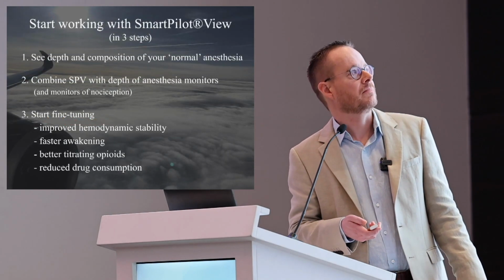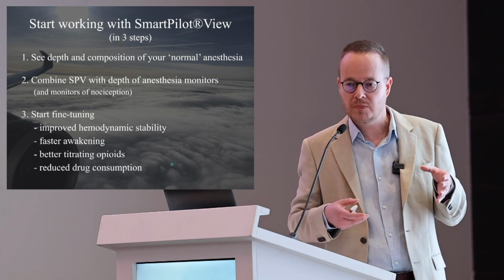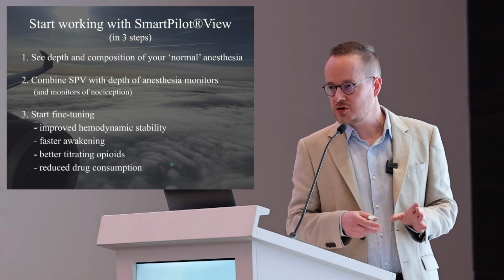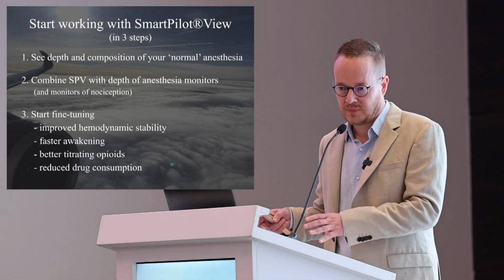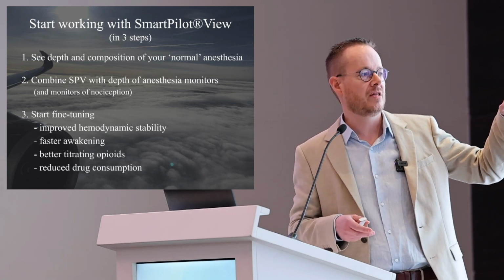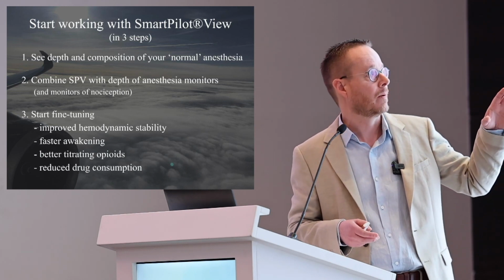So in conclusion, how do I suggest that you start working with SmartPilot View? First, just don't do anything other than you do normally, but enter the data in SmartPilot View and see where you are on the screen. That will already be a revelation. It was for me 15 years ago.